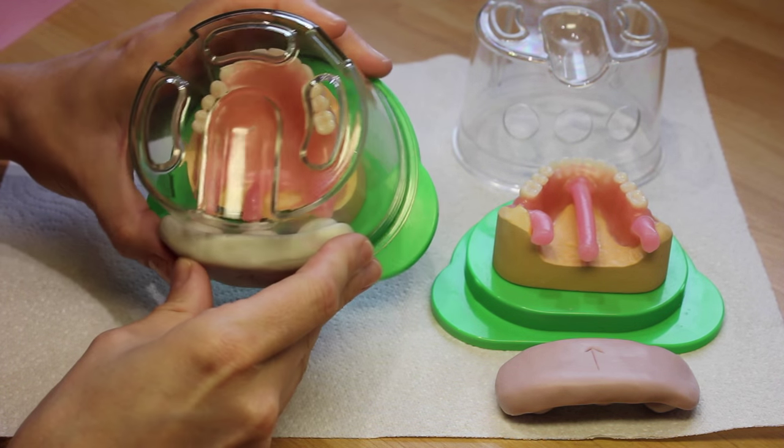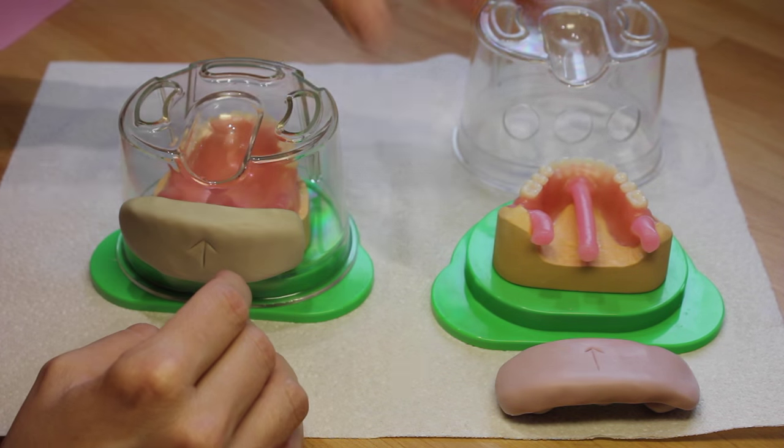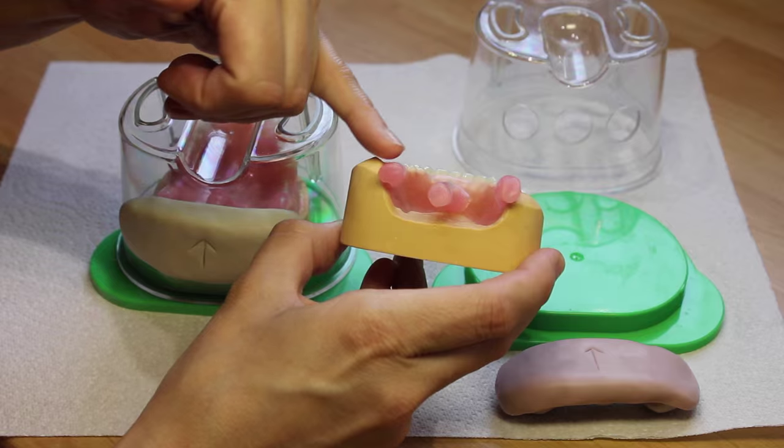When you put your bung on you may find there's a slight gap — that doesn't matter, you can remove the silicone later. Notice with this lower it has one heel that's slightly too high for the hole in the flask, so I've come round the side for the air channel.